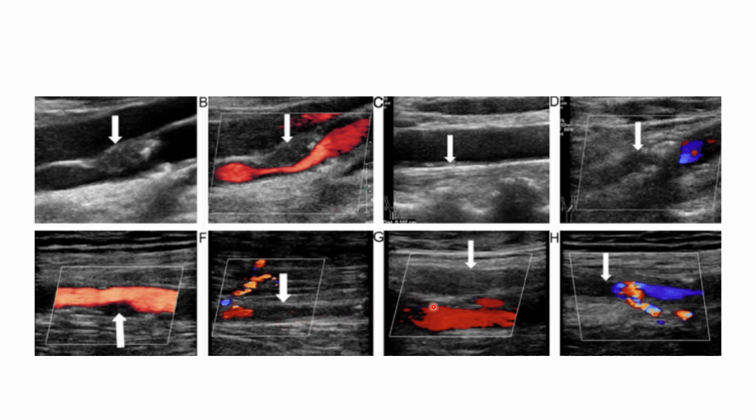Okay, and then here again, you see some irregularity in that wall. You see this disruption in the intima here. Here, you're going to identify that aliasing from turbulence. So it's showing that blood is moving away here and toward here. And so it's moving in a dishwasher sort of effect or a washing machine kind of effect, causing turbulence, indicating that there is something in this region preventing the blood from flowing normally.